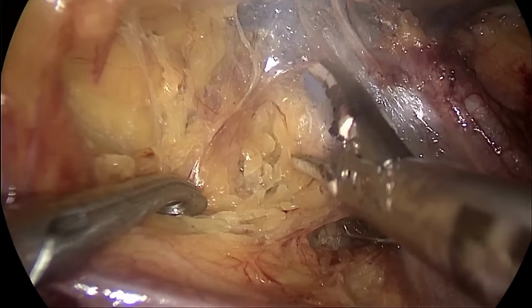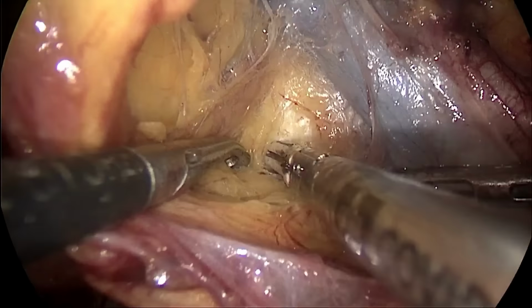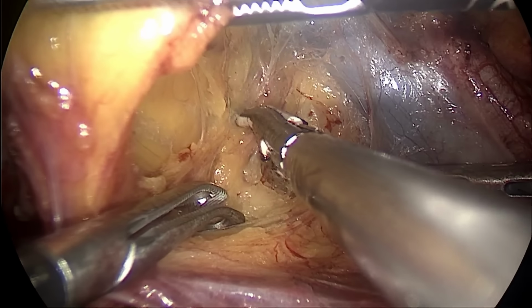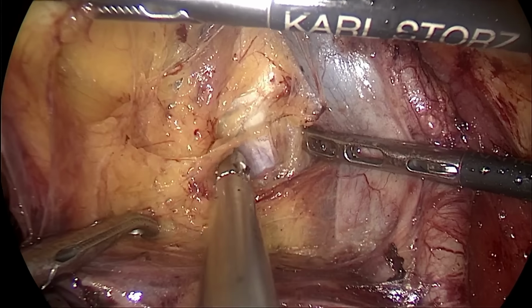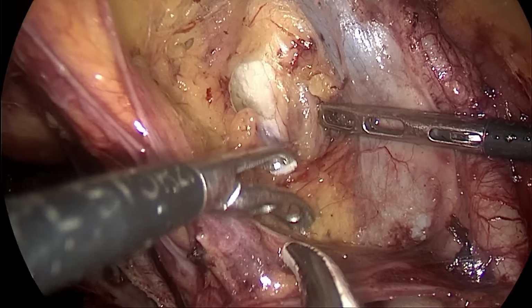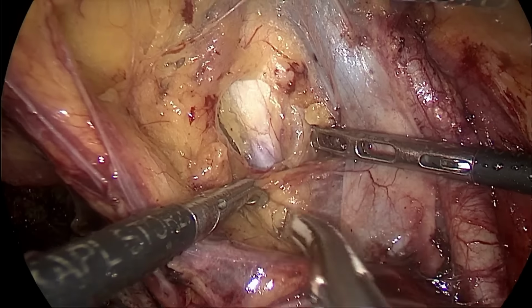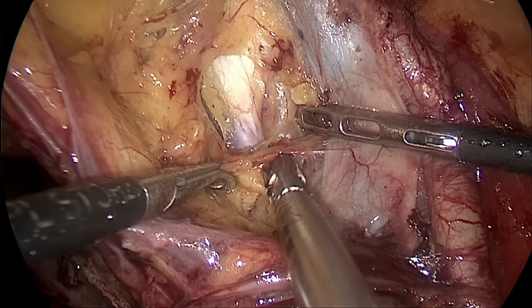So after that, we are proceeding medial to the external iliac vein. That's our pubic bone. So here we have to be very cautious, because corona mortis will be there. Corona mortis is a connection of the external iliac system and the internal iliac system. It is an accessory obturator vein that is coming out from the external iliac vein, medial side.